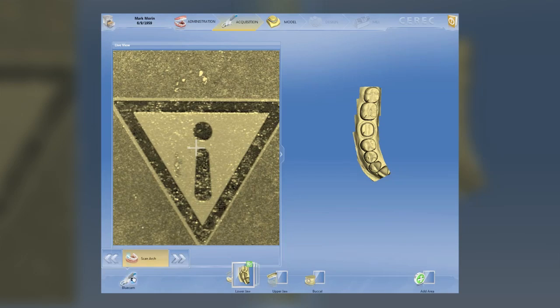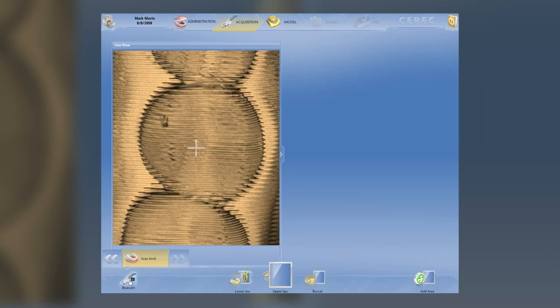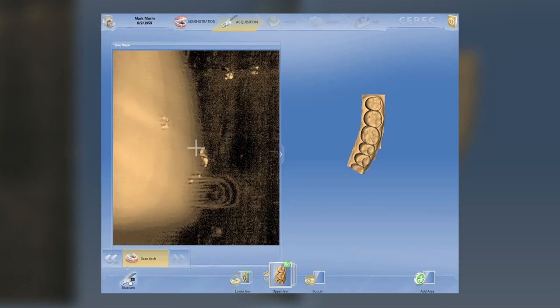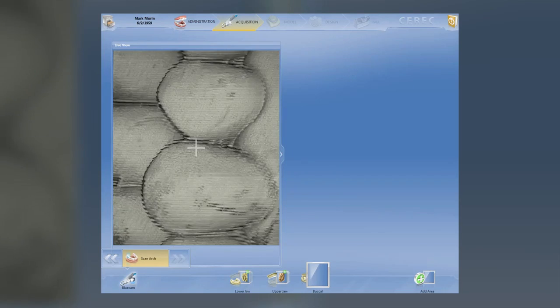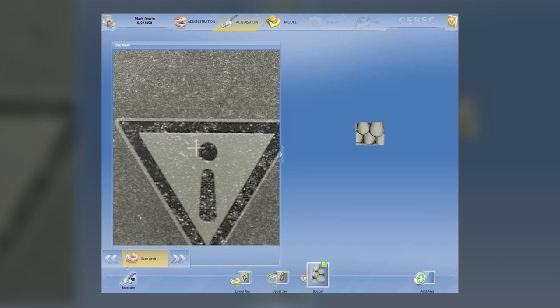We're going to put the camera down, turn it off for a second, and move over to the upper jaw. Now we're going to do this in articulation mode with a buccal bite so you can see exactly what it looks like. We're going to activate the camera and start taking pictures of the upper jaw — the molar, molar. As you know, if I'm going to take a buccal bite, I prefer to go to the canine in order to have great articulation. So I go all the way to the canine. Okay, we're going to turn that off and now we're going to take the buccal bite — activate that, turn the camera back on, take the models and put them together.